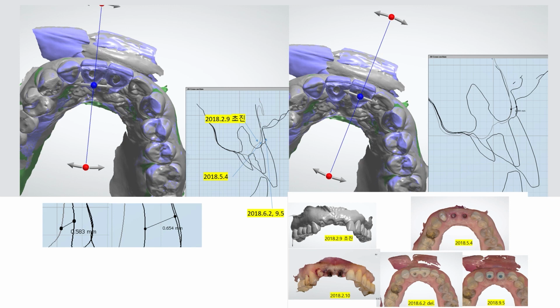So, screw abutment resulting in, you see, the final abutment from the gingiva perspective. So, temporary resulting in gingiva molding. So, increasing the buccal volume is possible, in other words. And when you remove the temporary, the immediate external change is not much, but internal slumping could happen. And you should consider that in creating the final abutment. That could be the conclusion we can draw from here.